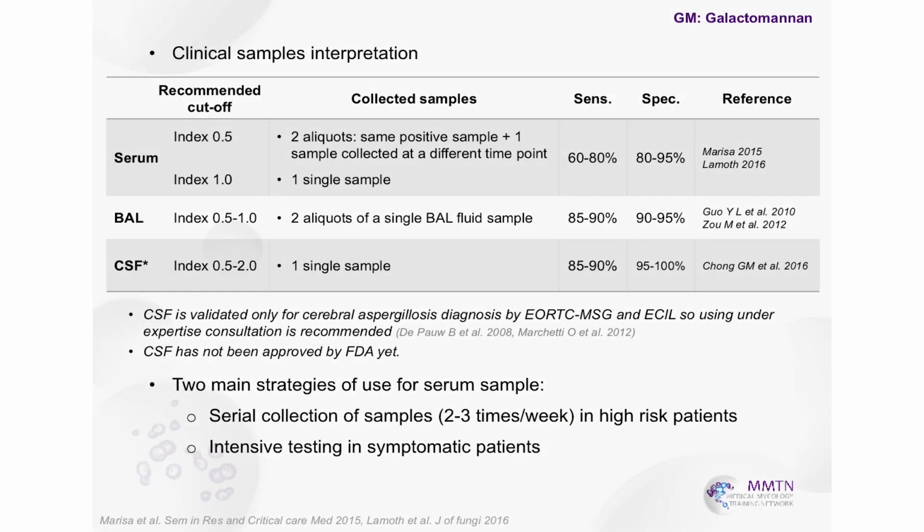So I do not need to show this one. This is a normal ELISA technique. It seems very easy, but actually the technical side still has problems. In our experience, sometimes in one box they have two kits together. If you switch from this box and use the reagent from another box, the cutoff will have a problem too. I don't know how the company handles it, but they say, please do not switch the reagent between different boxes.